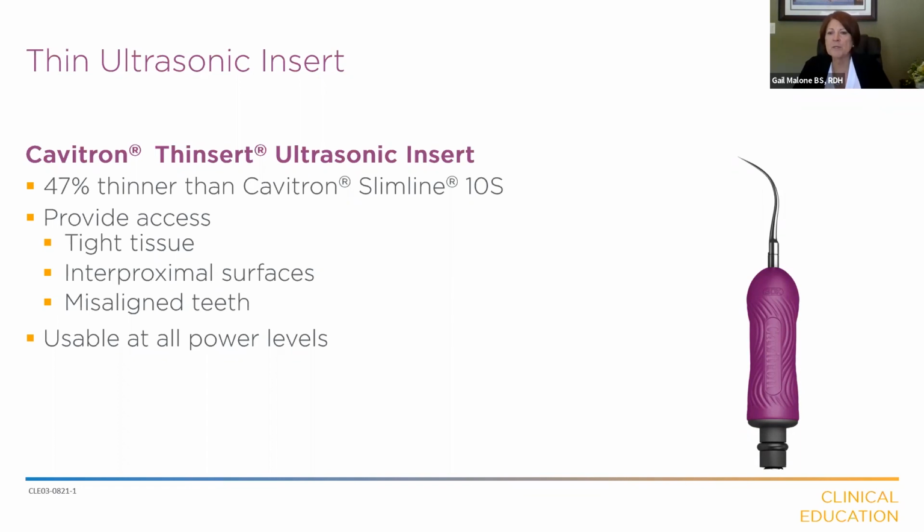Excellent for biofilm disruption. Given the straight design, the subgingival use would follow the recommendations in that it could be used universally in areas of healthy tissue, and it could be used as needed for gross removal of subgingival calculus, but limited generally to the anterior teeth when performing final root debridement. We'd want to focus on our curved inserts to meet the complex root anatomies that we have in the posterior areas of the mouth. We mentioned spray patterns earlier.